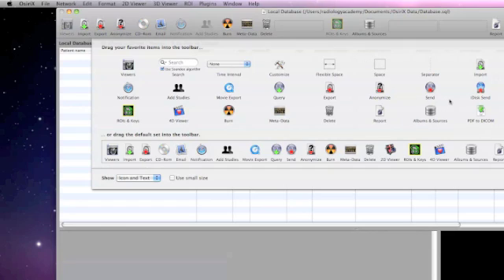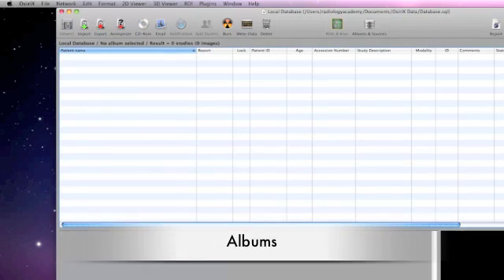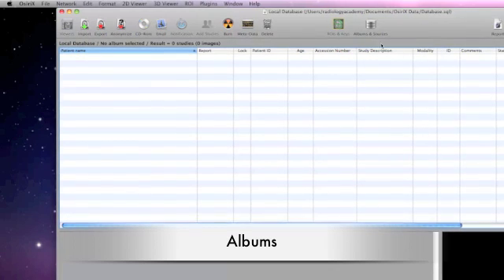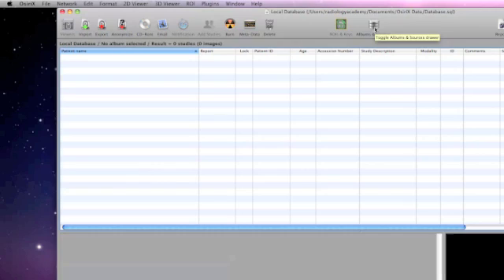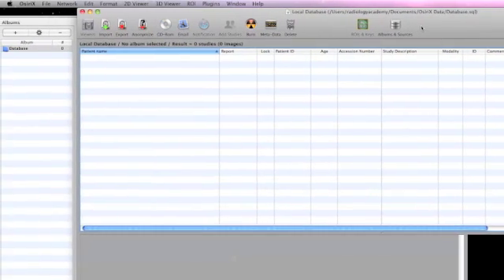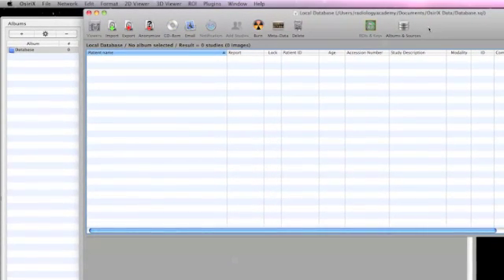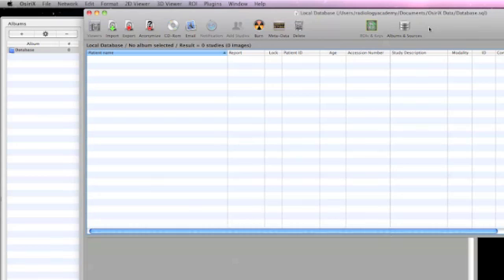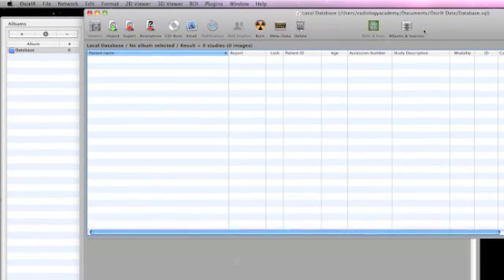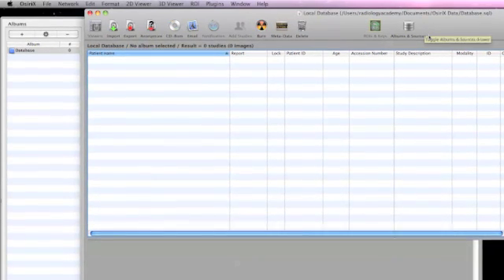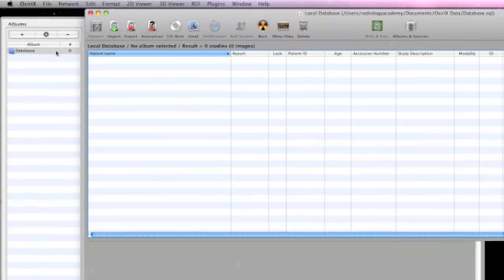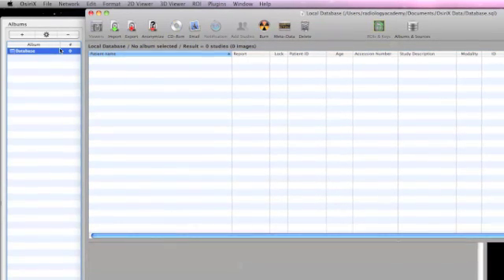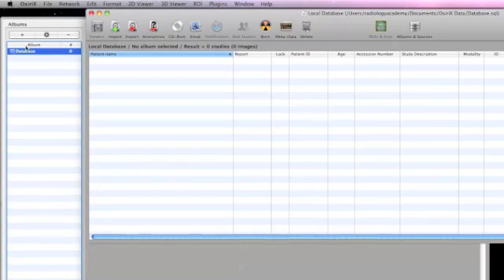Now, having moved to this stage, we want to look at our database and albums. They may or may not be visible on the left-hand side. If not, we toggle the album and sources to identify the databases. The database currently has no films within it. As we load films up using CDs, the number of cases will be identified to the right of the database.